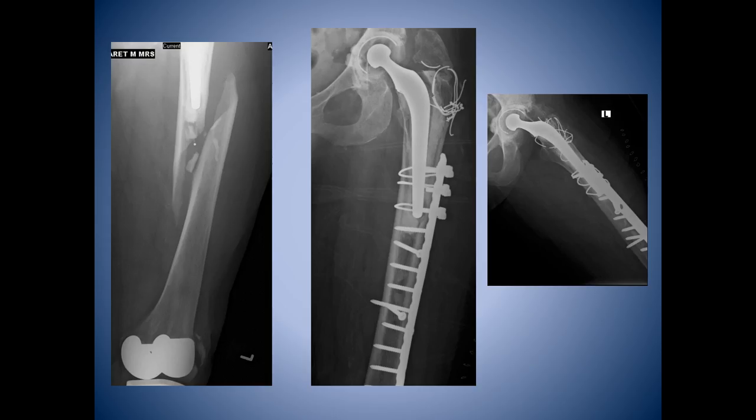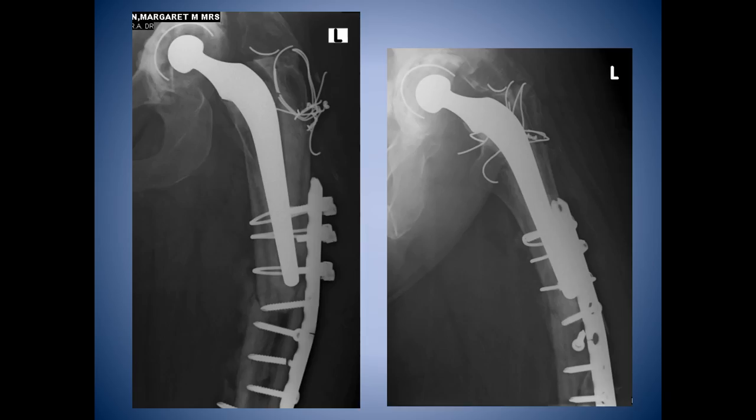Here you see another patient, a really nice long spiral fracture. It looks good, it's at the tip there, nicely plated, the fracture's well reduced, everything looks hunky-dory, and this is what happens. That whole bit of bone there is ischemic, and there's no support medially there, and the plate will then break.